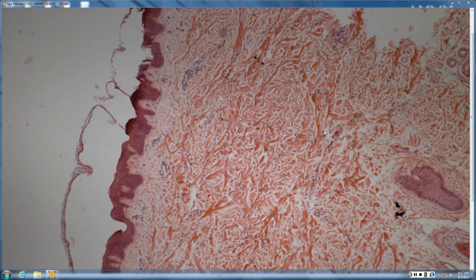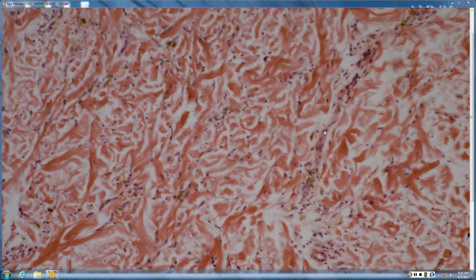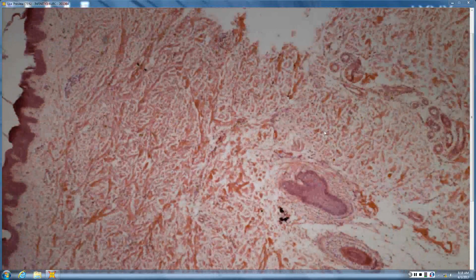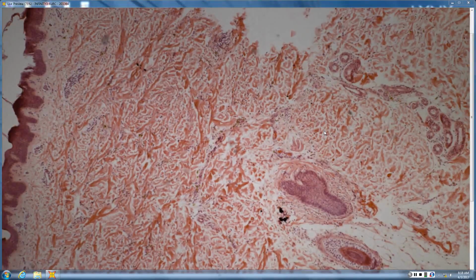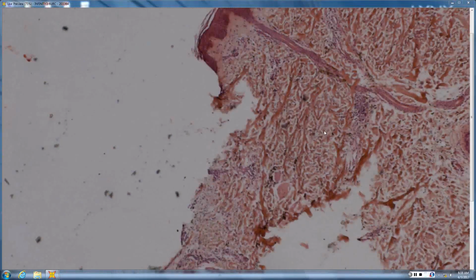Okay, what do you see? Sure. I see some hemosiderin. Yeah, there's hemosiderin. And the hemosiderin's kind of not in the center, but at the periphery on both sides. Right. So it might have made a ring, like a targetoid hemosiderotic hemangioma. And then you look, and not surprisingly, a little bit of this hemosiderin is around the eccrine coil, like it's trying to form some kind of chronic vascular proliferation around pre-existing structures. And if you looked in step sections, you might find some dilated staghorn spaces up high, so it's a THH.